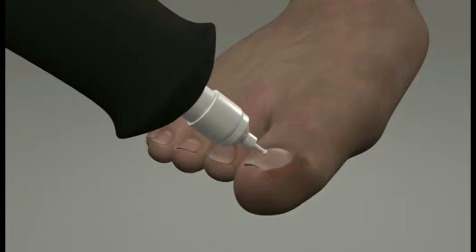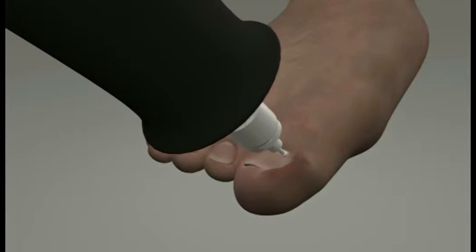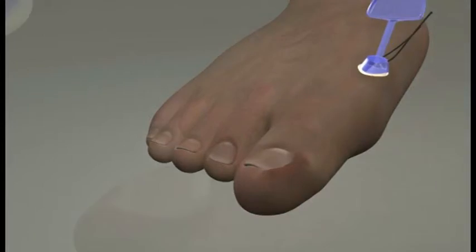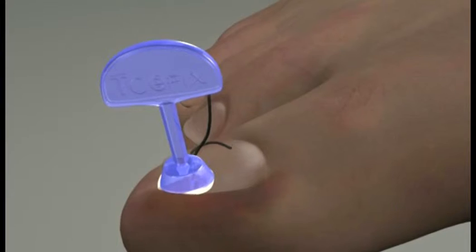We clean the base of the anchor and the crane in the same fashion. Now we apply epoxy glue to the base of the crane and the anchor and glue the anchor to the deformed side of the nail.